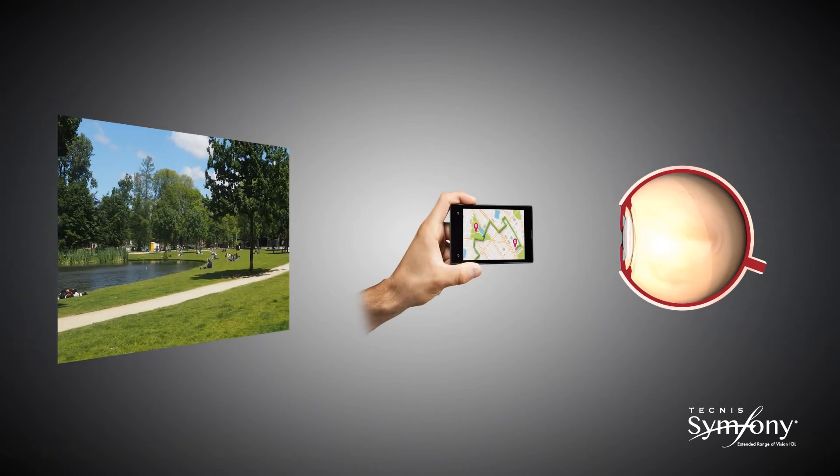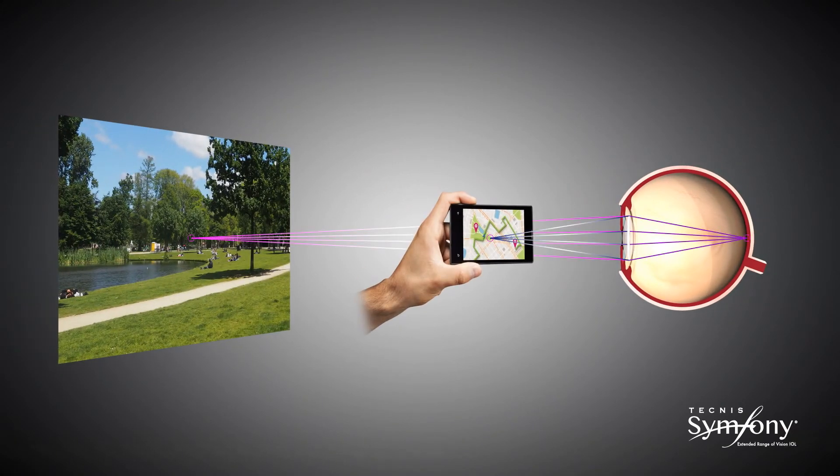In multifocal IOLs, diffractive technology transmits the light in such a way that it converges at more than one focal point.